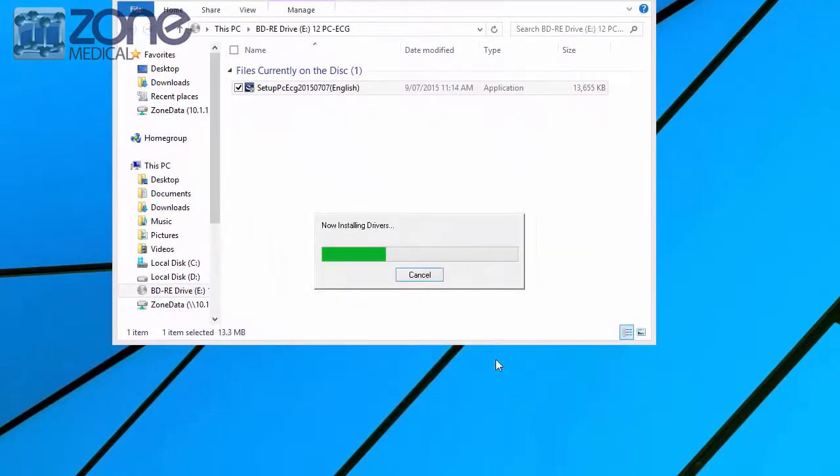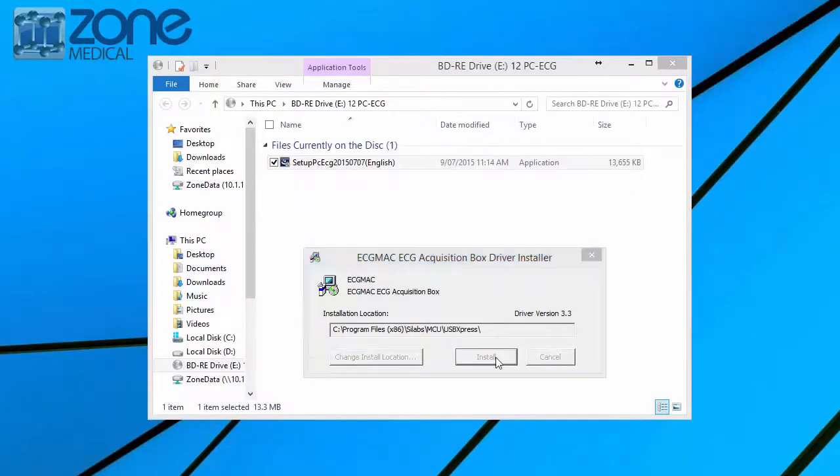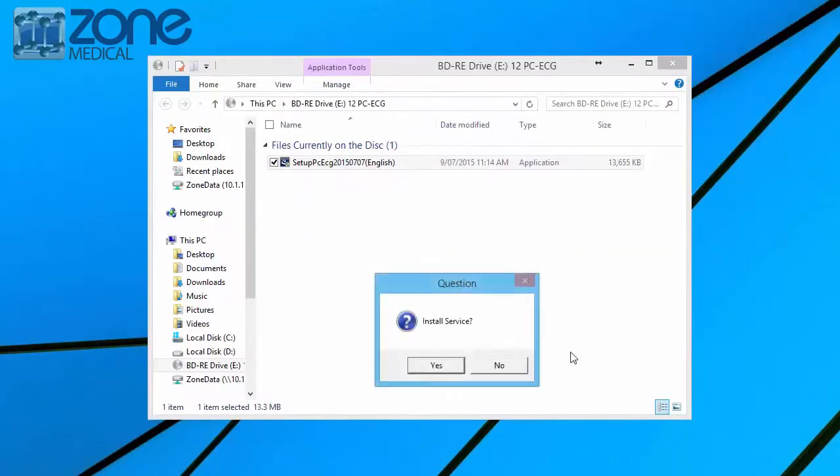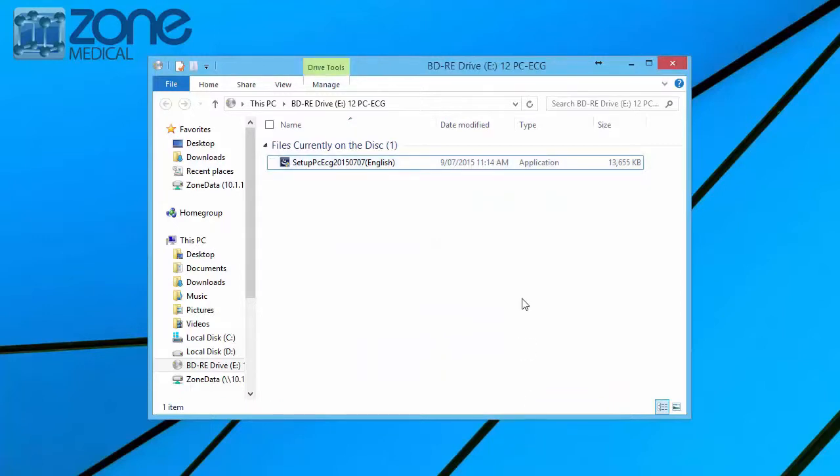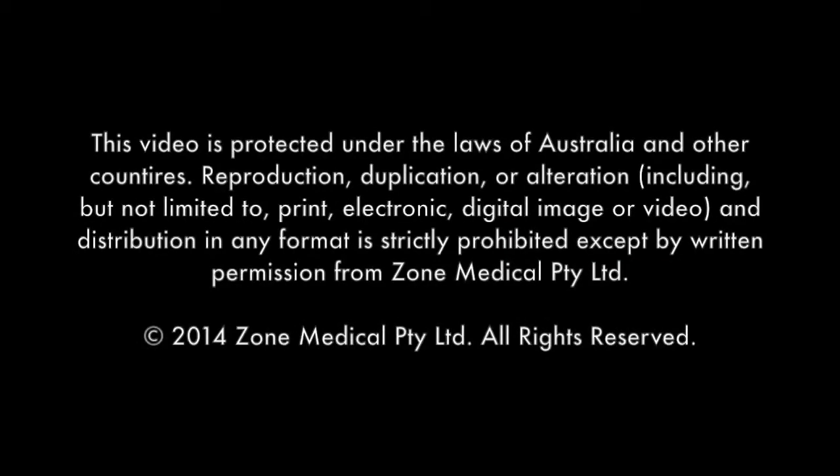Once you've clicked next and installed, it will scan your computer — just press yes to all the questions. Then your PC ECG icon will show up on your desktop. Thank you so much.